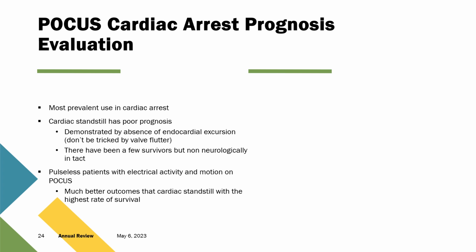The most prevalent use of point-of-care ultrasound in cardiac arrest is prognosis evaluation. The biggest purpose of this is to evaluate whether the continuation of CPR is going to be effective or not. Now, cardiac standstill has an extremely poor prognosis. That means that when they're completing the CPR, they take a pulse check break and you evaluate the heart, you will see absolutely no movement. When that has occurred, they'll call that cardiac standstill.